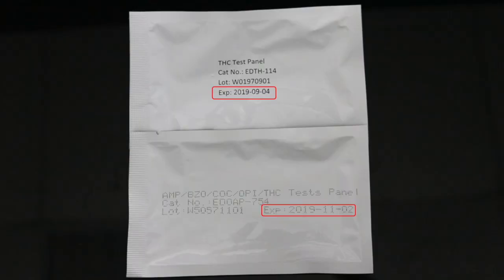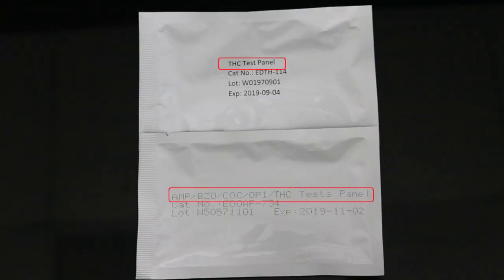The expiration dates and drug names tested are found on the outside of the individual pouch.